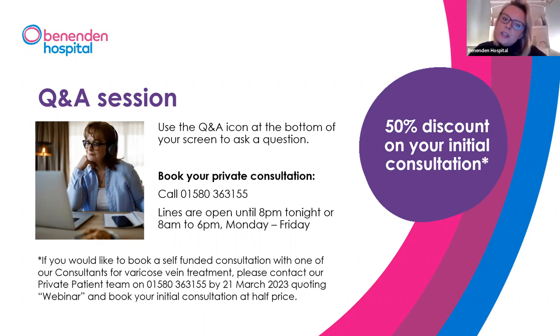Lloyd asks, does EVLT just seal the valve, or is the laser withdrawn down the vein sealing as it goes? Is the sealing always followed by a phlebectomy to hook onto the vein? So the answer is the whole vein is sealed from the top all the way down as far as we can go. It's usually about 30 or 40 centimeters.